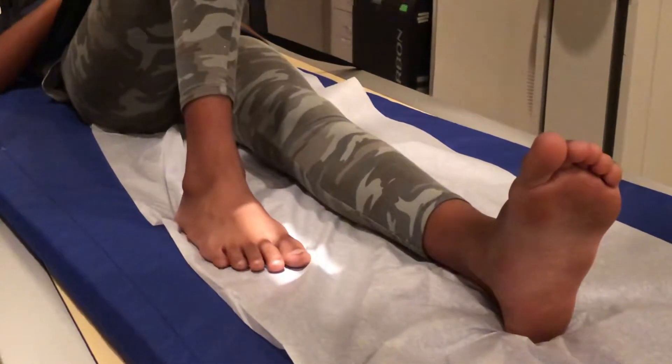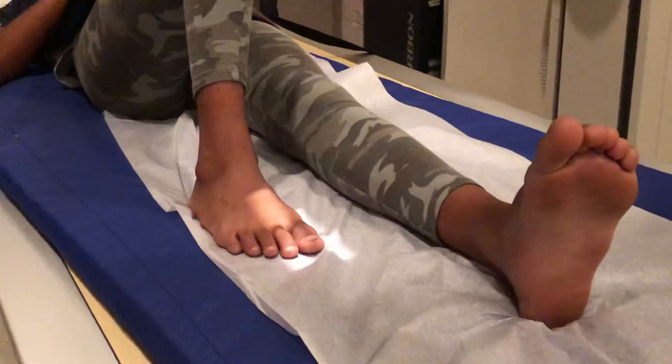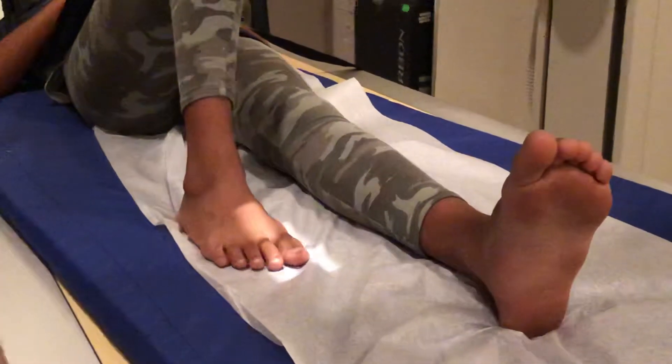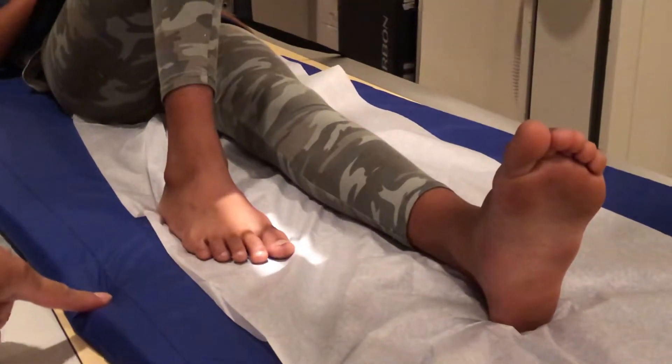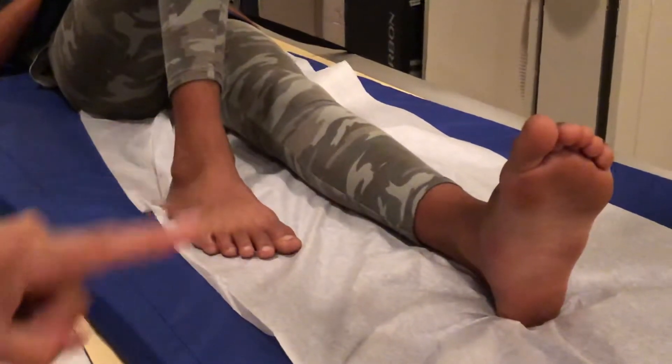Hi, you clicked on this link because you want to know how to take an x-ray of the big toe, and I'm going to show you how to do it perfectly every time. So this is the big toe x-ray exam. What we're gonna do is four views: an AP, both obliques, and a lateral.